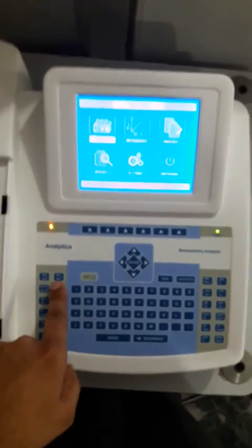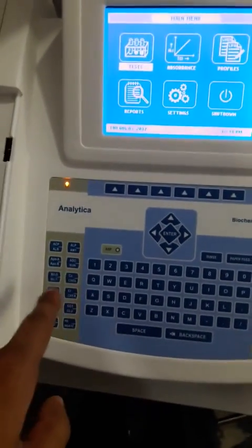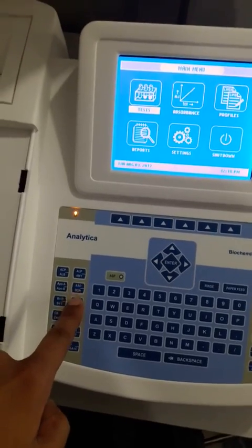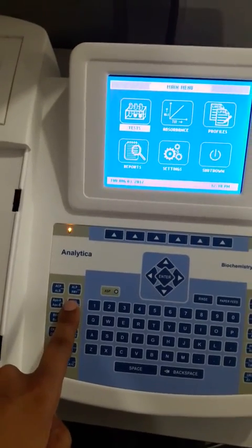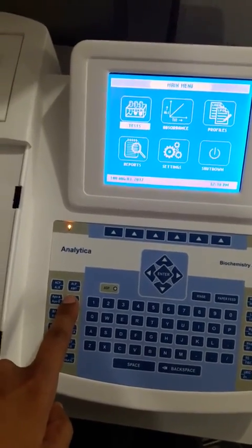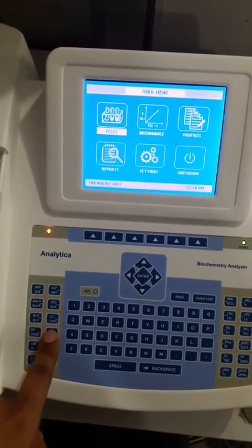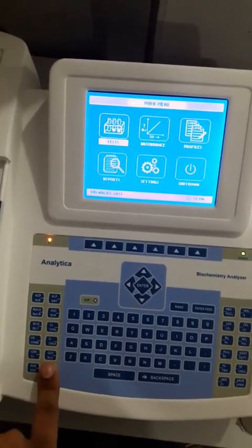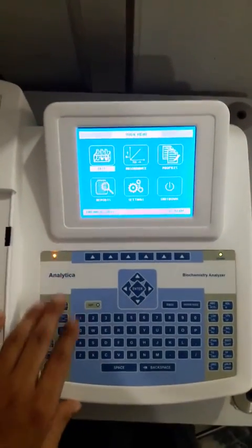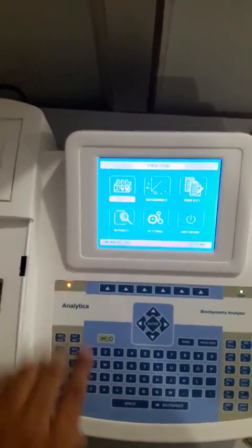You can see one key is having two test names written on it. When you press this key a single time, you can select the test written on the upper side. If you want to select the lower side test, you have to press it twice.